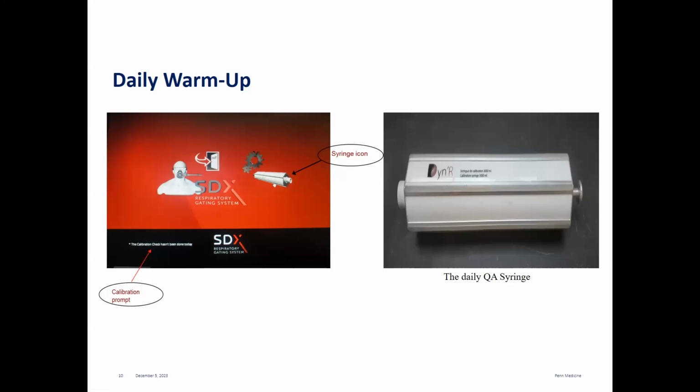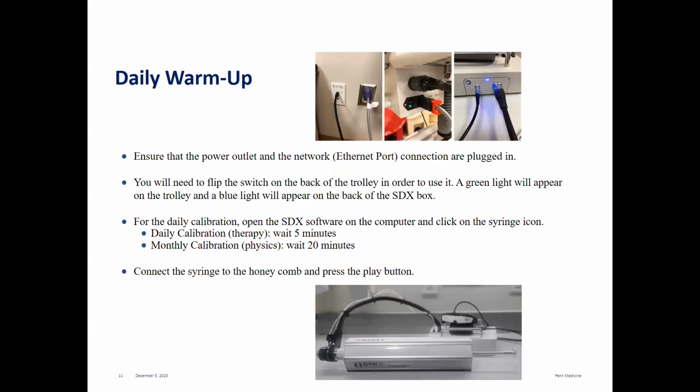The device used is the daily QA syringe, and it is inserted into the honeycomb. The QA syringe allows for easy calibration. So you have to ensure that all of the power outlets and network connections are plugged in.